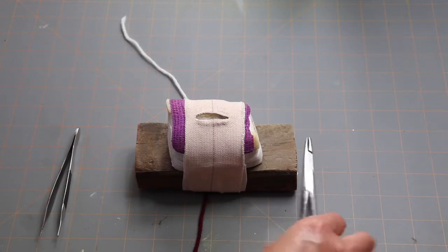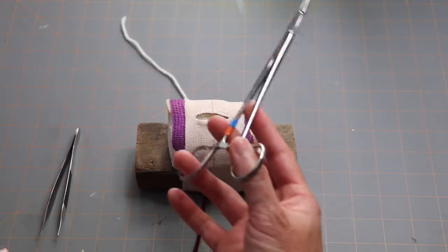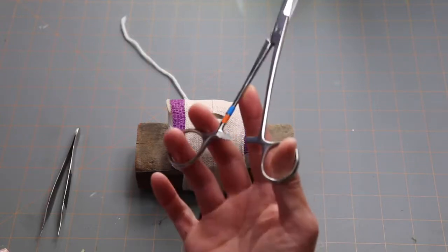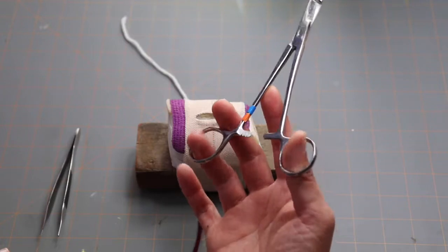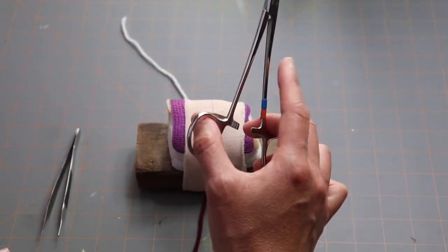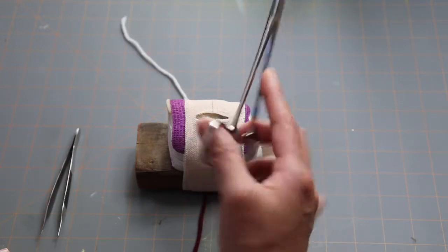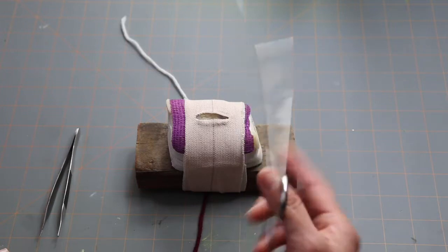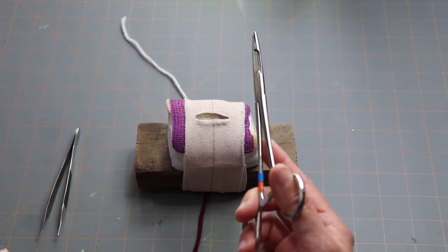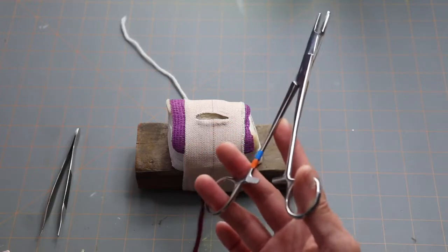First of all, here are your instruments. You have your needle holders, and these are hinged instruments, so anytime you have a hinged instrument you're going to hold them with your thumb and your fourth finger. On the other side, use your index finger as a brace against the shaft of the instrument — that'll give you stability and strength as you're passing a needle through skin or whatever tissue you're suturing. This is how you hold your needle holders.